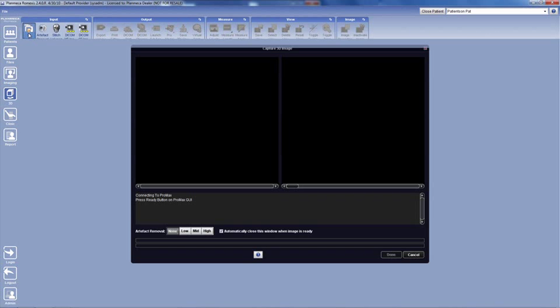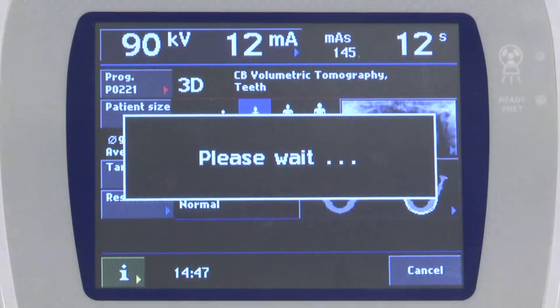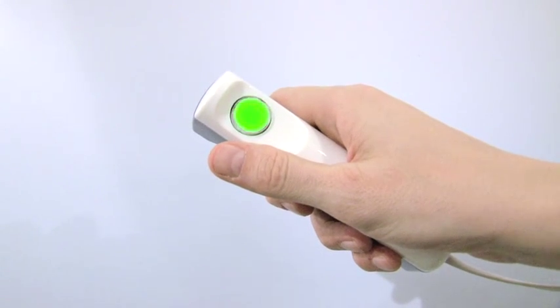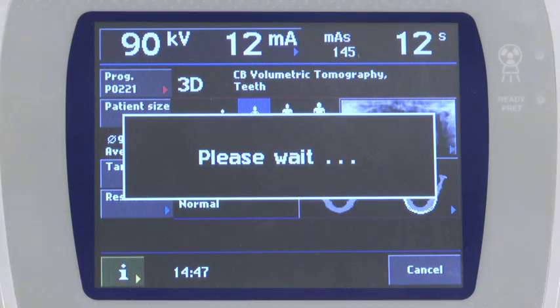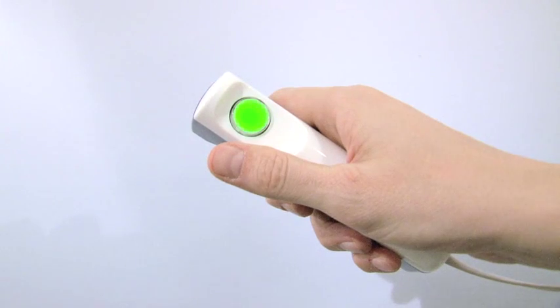The following communication status dialog will appear. Wait until the dialog says 'press ready button on the Promax GUI.' Press the ready button on the control panel. Ask the patient to close their eyes and swallow. It is important that the patient does not move during the scan. When the ready button turns solid green, ask the patient to not move and press and hold the exposure button until the rotation completes.